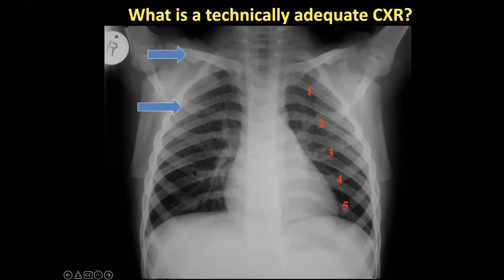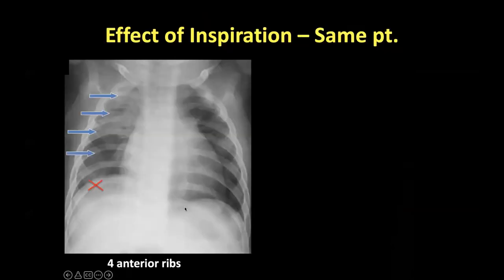In pediatrics, it's far easier to focus on the anterior ribs rather than the clavicles for rotation, as in adults. In a normal chest X-ray, we would like to see five to six full anterior ribs. So if this is your fifth anterior rib, you're seeing the whole thing. We usually use the right side. On this example, we have only got four anterior ribs — one, two, three, four — and we can't see the whole of the fifth rib.